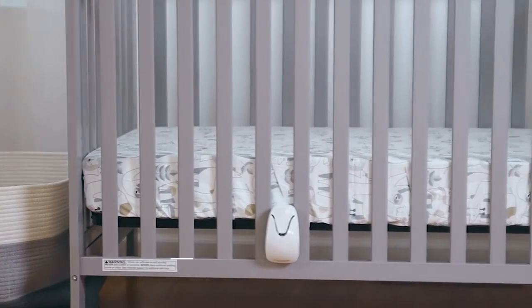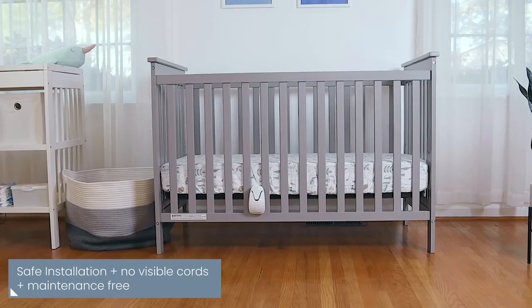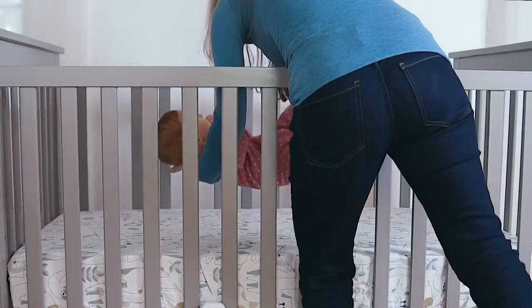One time installation — that's it. It really is that easy. With no visible cords and no direct contact with your baby, you can be sure your baby is safe. Your baby won't even know the monitor is there.